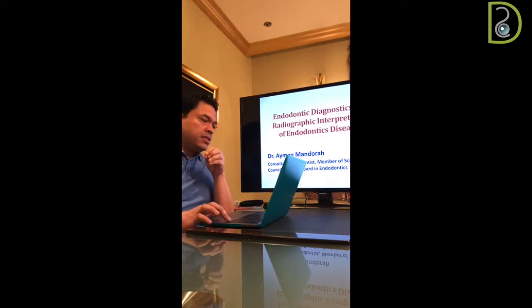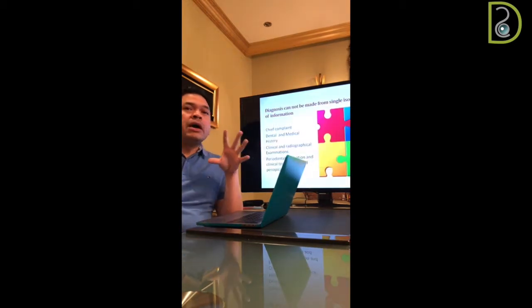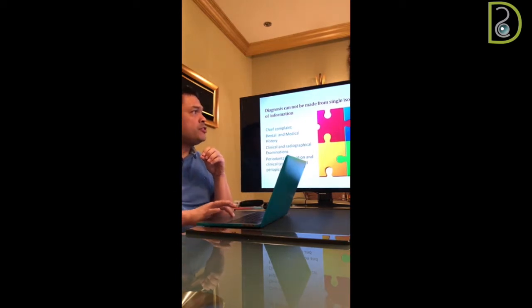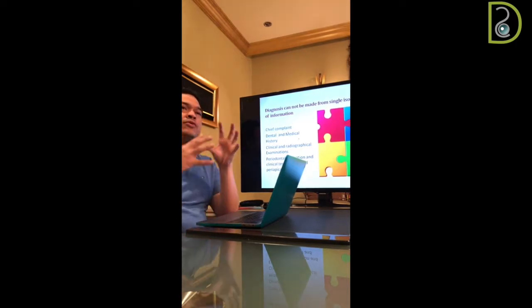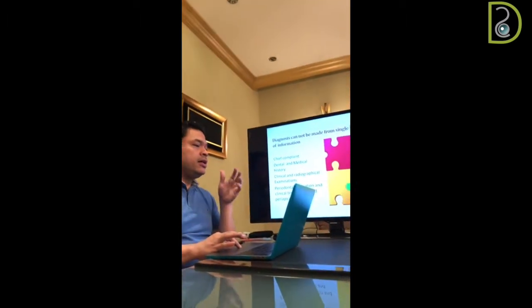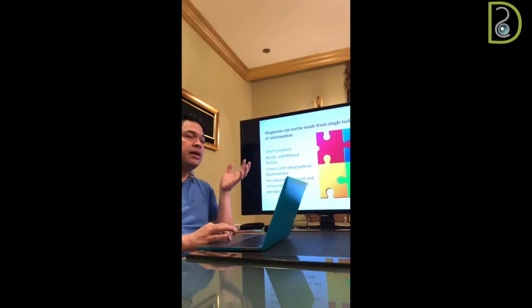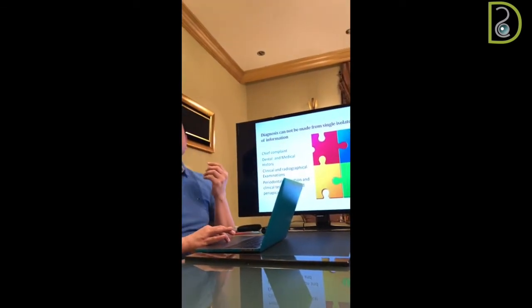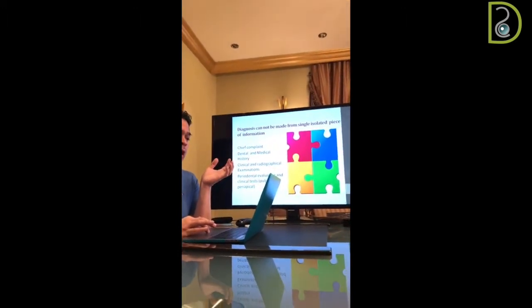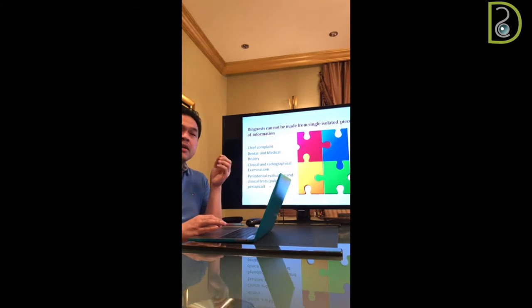Let us start at the beginning by talking about the components of diagnosis. If you think that diagnosis is about components, you have to fit them all together. We start with the chief complaint, dental and medical history, then clinical examination, whether clinically or by radiographs, ending with periodontal and clinical tests. All this information is very important to have a correct diagnosis.